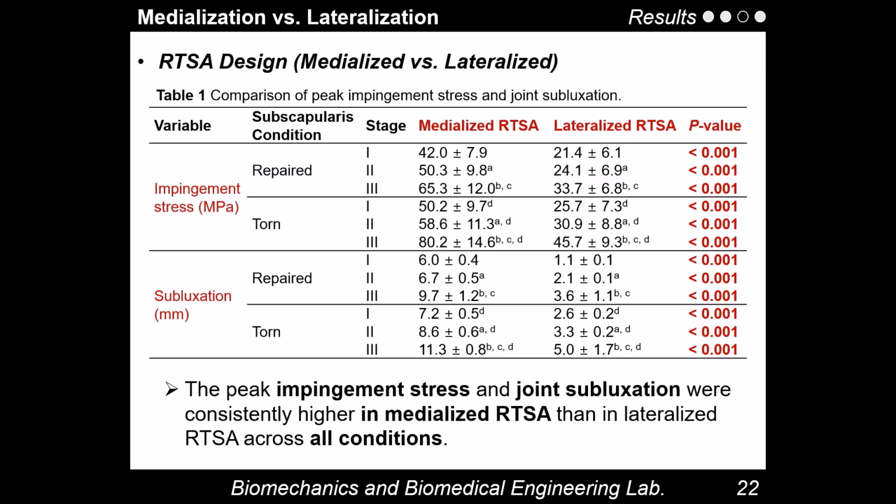First, I would like to focus on the overall comparison between the two RTSA models. If you look at the columns for the medialized and lateralized RTSA, a very clear trend emerged immediately. Across every single scenario, we observed that both peak impingement stress and joint subluxation were consistently higher in medialized RTSA.